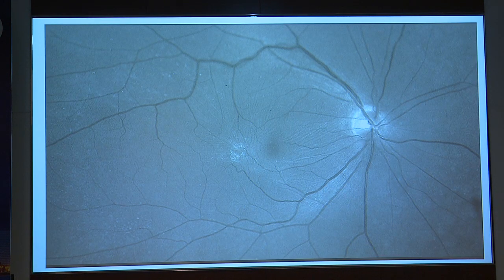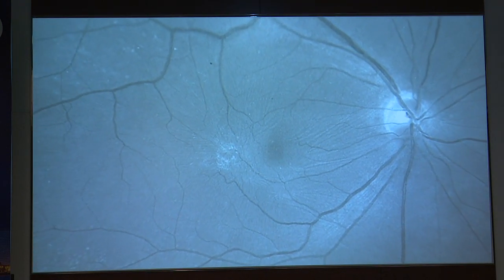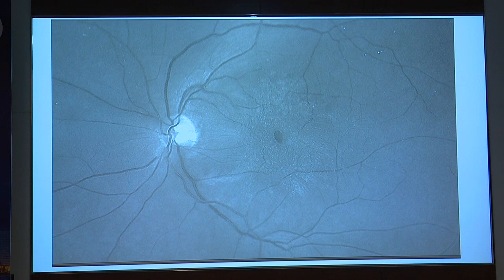Similarly, we are doing screening for a general patient who comes for a follow-up, and you blow up, and you can see that there is a definite ERM there. Or again, a patient who came for regular follow-up, you see that there is a lamellar macular hole with cellophane.